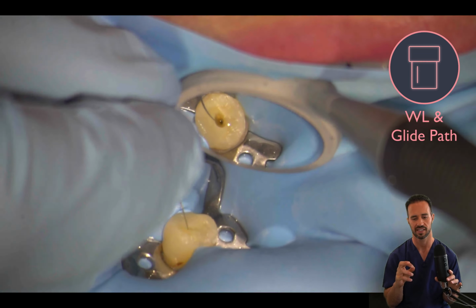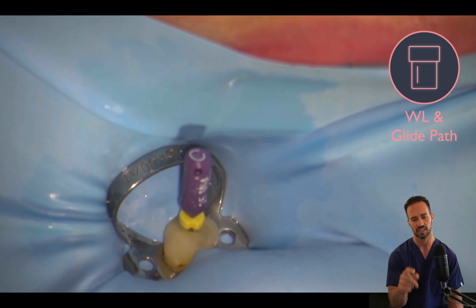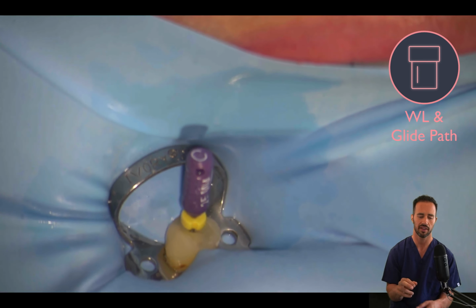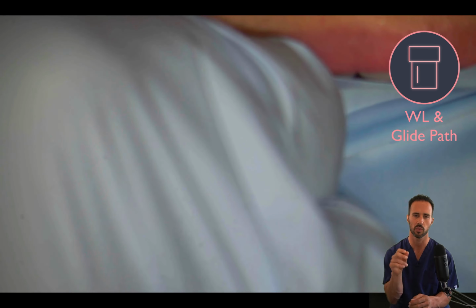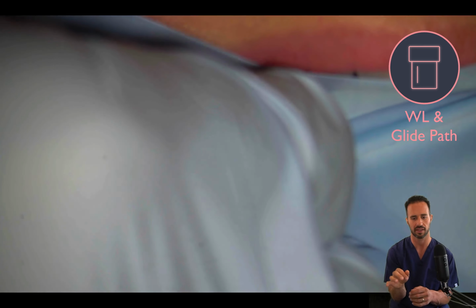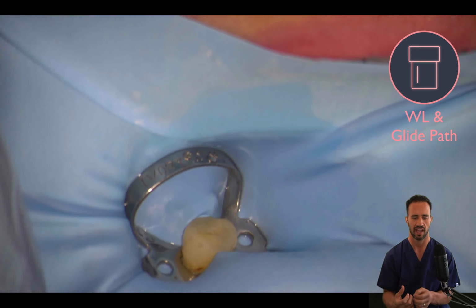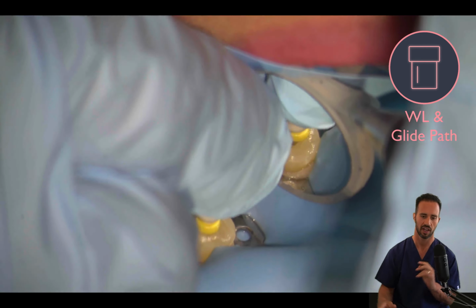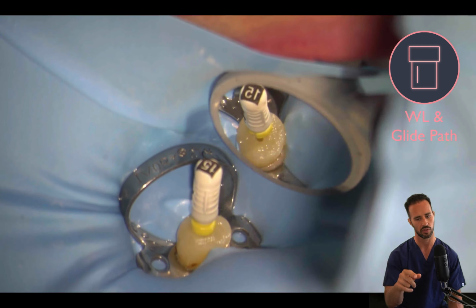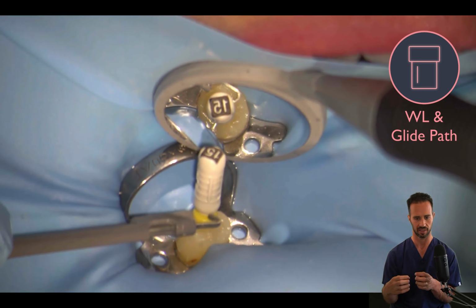So we have a size 10 file that we're introducing into the root canal, and you can see that this is a C file. C files I would recommend for sizes 8 and 10 because those are the files that oftentimes you're really working to get down to the apex with, and the C file gives you a little bit more strength. It's a little bit more rigid, and you don't really need this for the larger files. So sizes 15 and above, I would encourage you to use K files, which is what you see here with the little square on the top. That's the K file symbol.